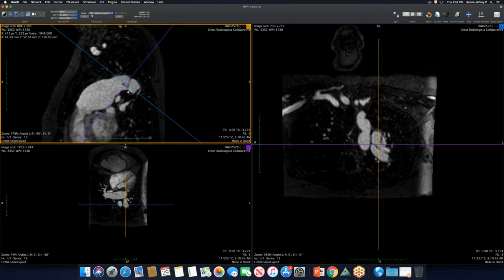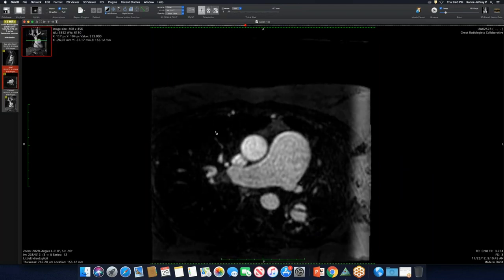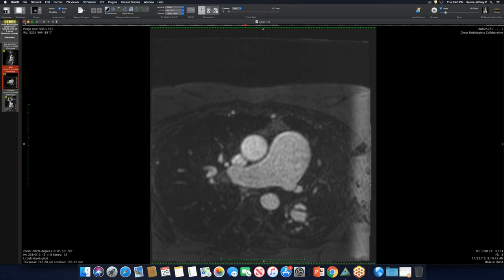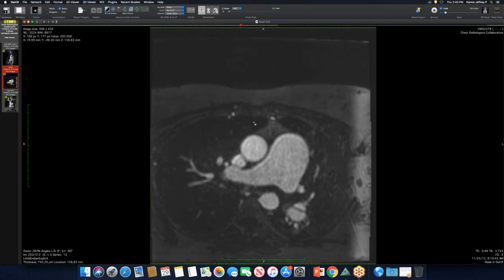There was one case at Mallinckrodt in the early 2000s in a patient with Marfan's who had a huge pulmonary artery and ended up with a spontaneous dissection. You can follow this one down pretty far and it doesn't look like thrombus. If doing a right heart cath, they often do a wedge pressure while there, so a wire could be in that portion of the artery.